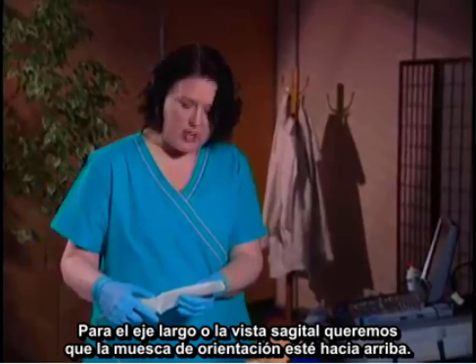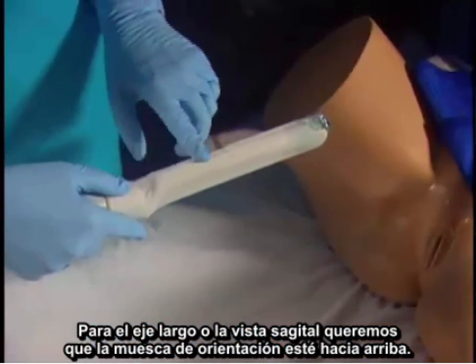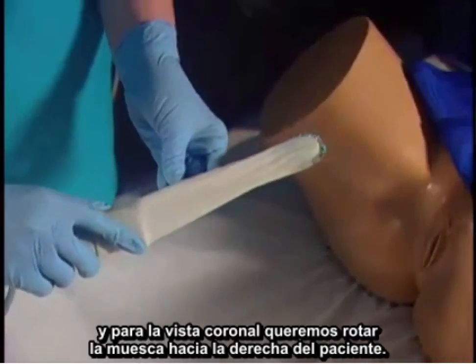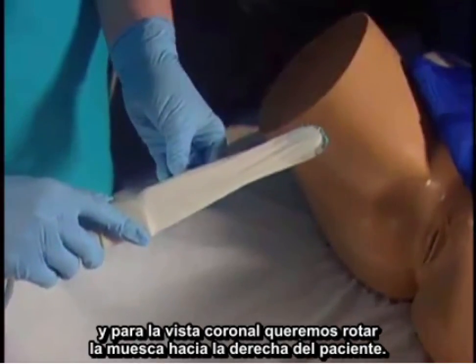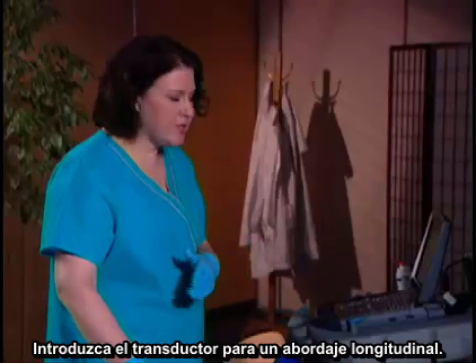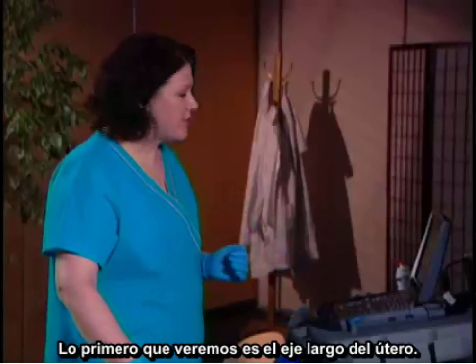For the long axis or sagittal view, we want the orientation marker up. And then when we go to the coronal view, we're going to turn that so it faces the patient's right. After we've inserted the transducer in a long axis view, the first thing that we're going to see is a long axis of the uterus.